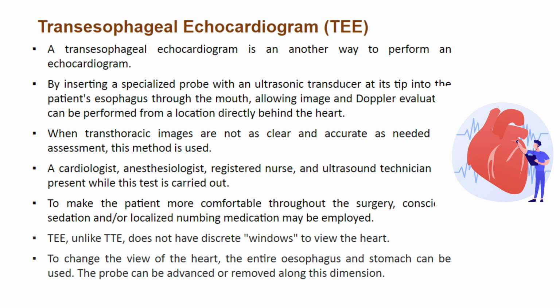When transthoracic images are not as clear and accurate as needed for assessment, this method is used.